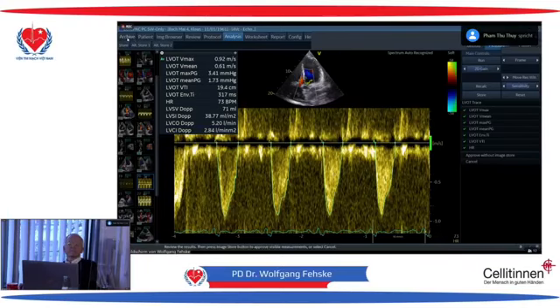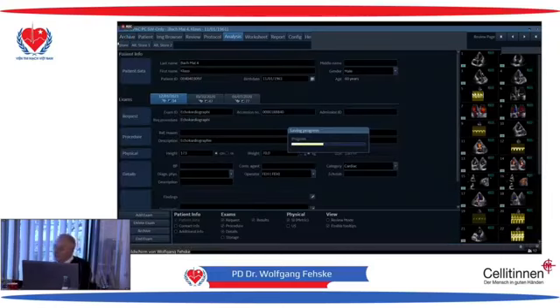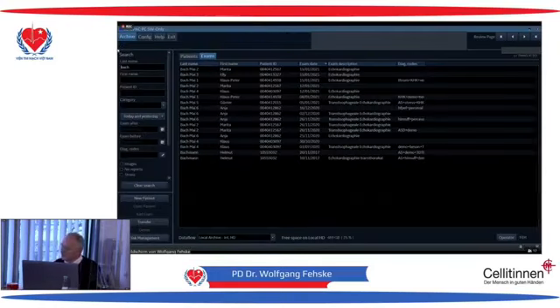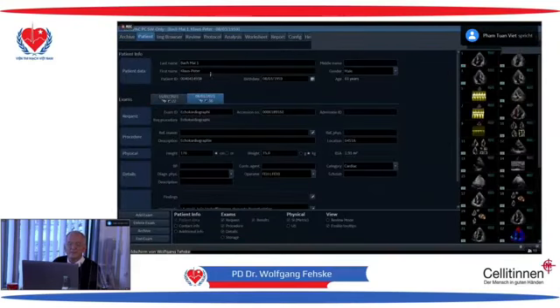So we are very happy with that patient. I'd like to show you another patient, case by case, like I did it when I was with you in Bach Mai. I will just show you a very simple case.